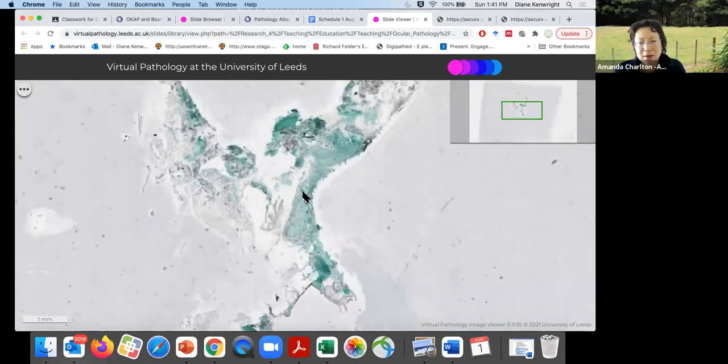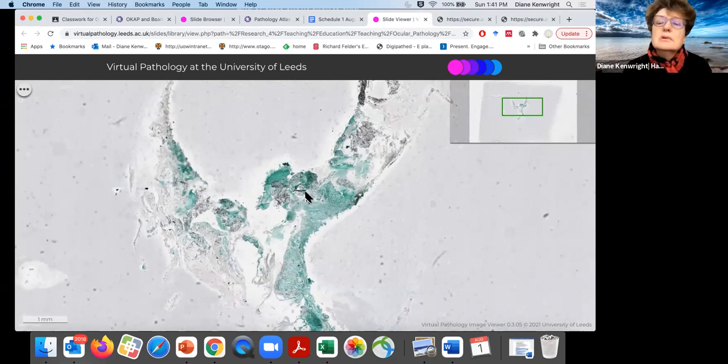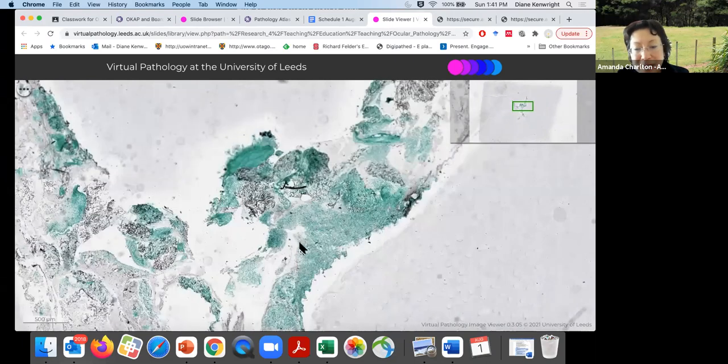Okay. So what I have here, gosh, it even looks like a cell block. Fragmented pieces of material. I'm not even sure if it's tissue. I'm just going to call it material. I think it's vitreous that's been sucked out. Is it? Okay, could be, yeah. And so looking at this, it's a green background stain and I see some black material.